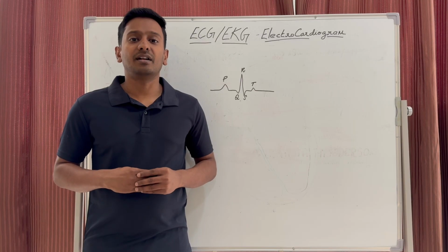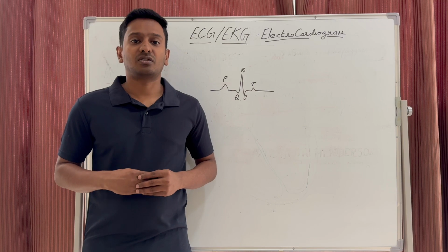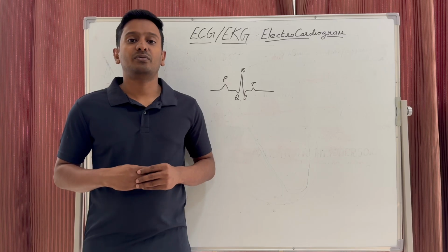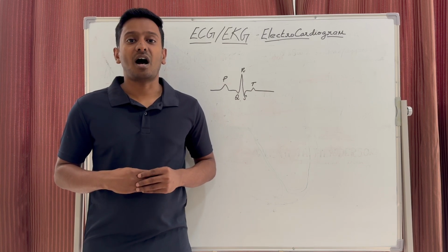It is a graphical representation of the electrical activities of the heart or the cardiac muscles. The function of ECG is to evaluate the heart rate and determine the heart conditions.